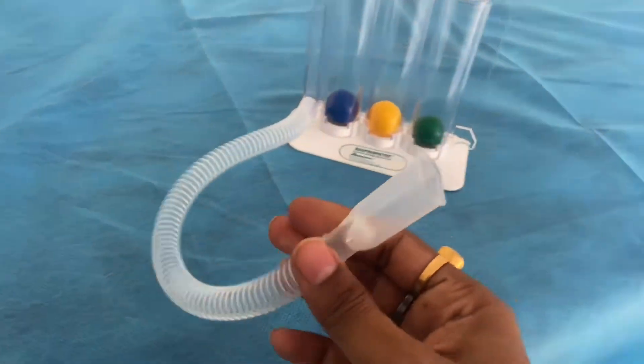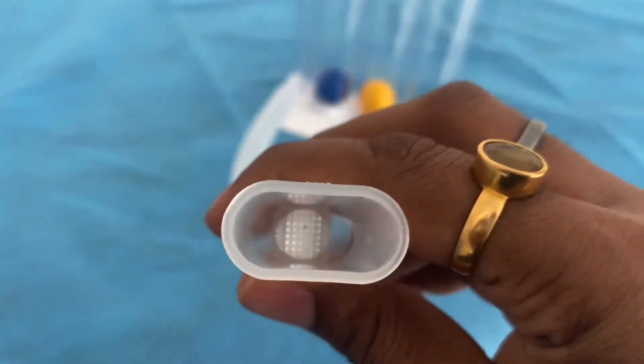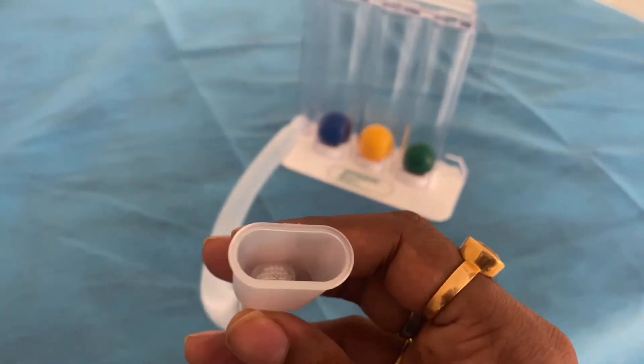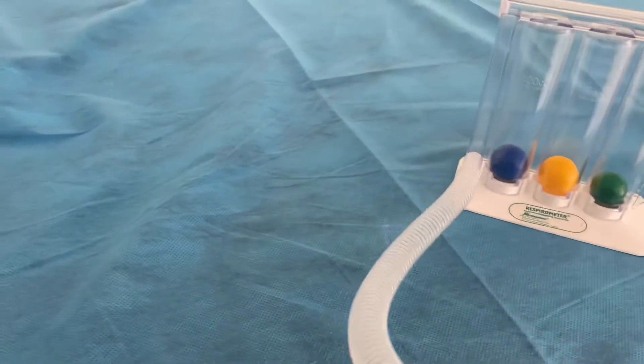By the way, this is the mouthpiece. You have to keep it in your mouth and seal it. Then you have to inhale and blow it — both ways you have to do it. So I'll show you once again how to do this.